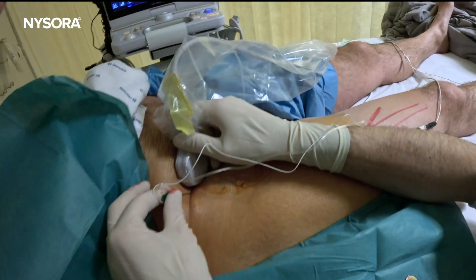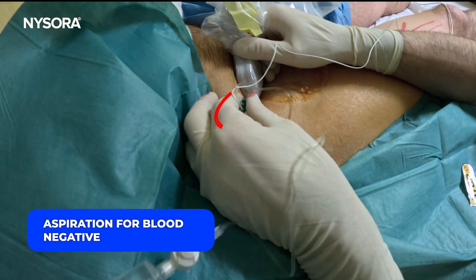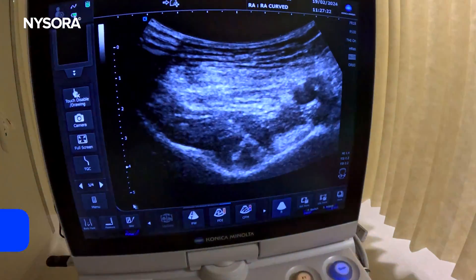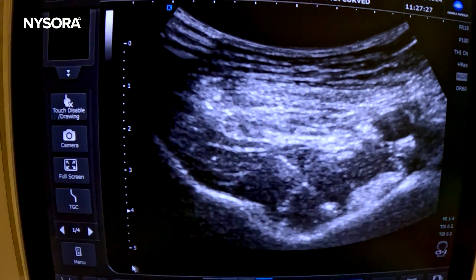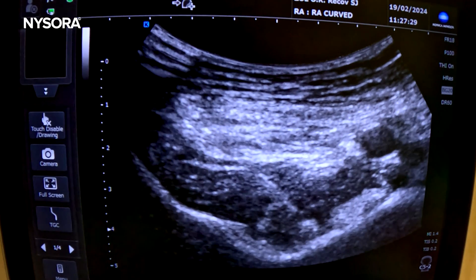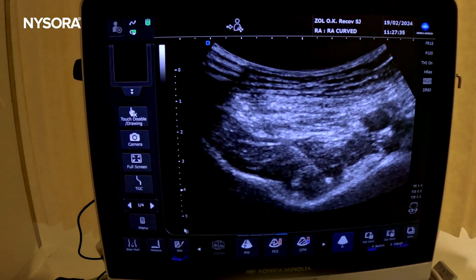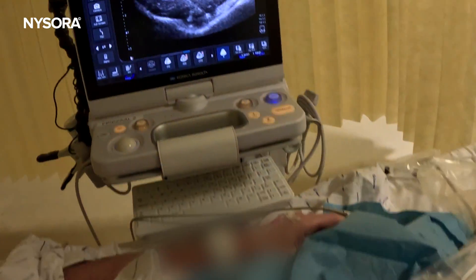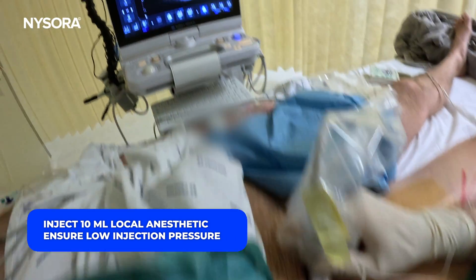We're going to aspirate — aspiration is negative. Injection of the local anesthetic results in a nice layering alongside the pelvic rim and behind the iliopsoas tendon, which we can clearly see here. Aspiration negative — we're going to inject 10 milliliters of local anesthetic after we assure that the injection pressure is low.